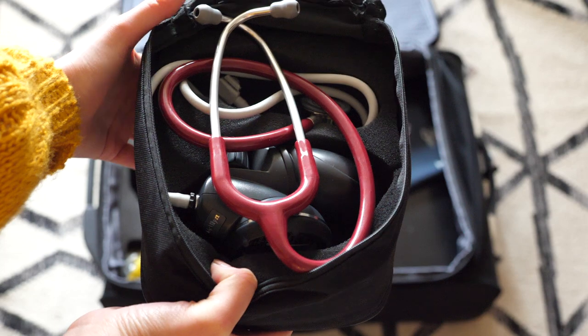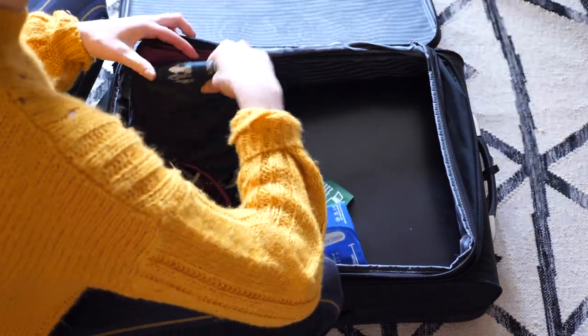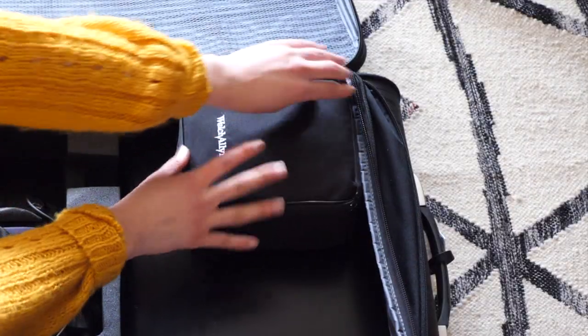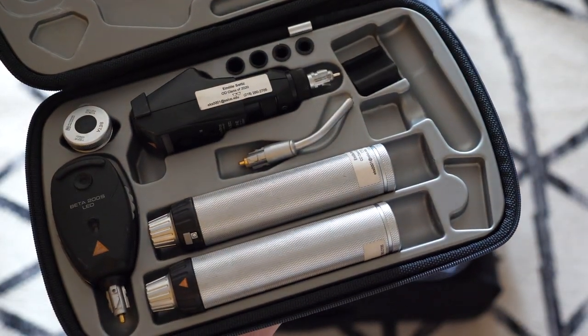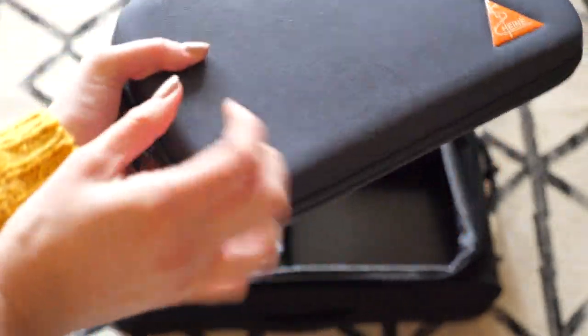Next, I have my Welch Allyn blood pressure cuffs, my sphygmomanometer, and my Littmann stethoscope — I love this combination. I've used all cuff sizes. I like having manual over automated; I just think it's more accurate. It zips up nicely and I pack it into the corner. Next is my diagnostic kit. Everyone's going to have a different preference, but I love my Heine. It already comes in the carrying case, so it's easy to zip right up and pack it in next to my blood pressure cuffs.